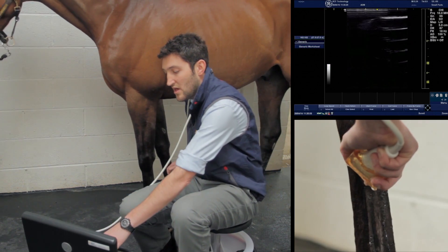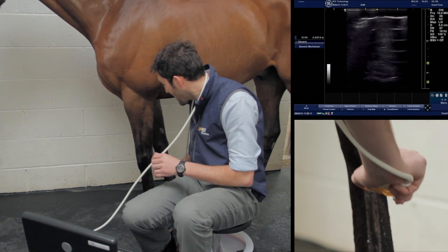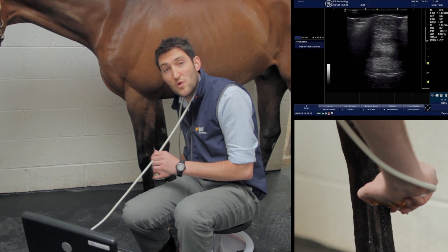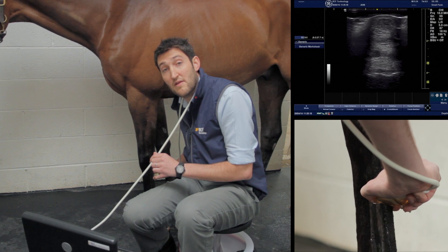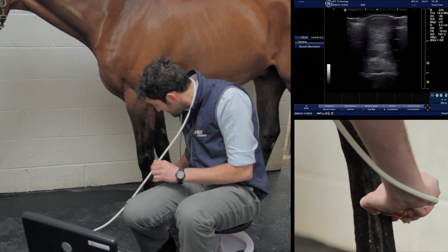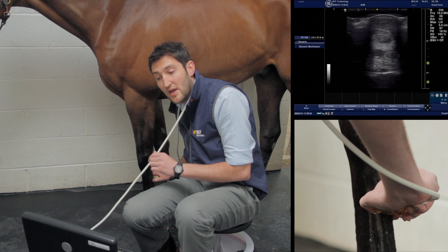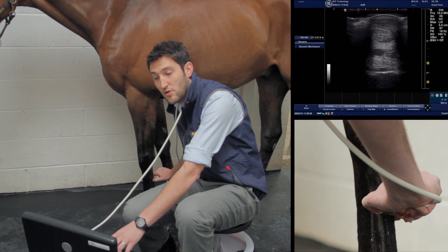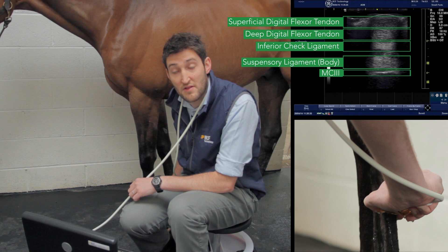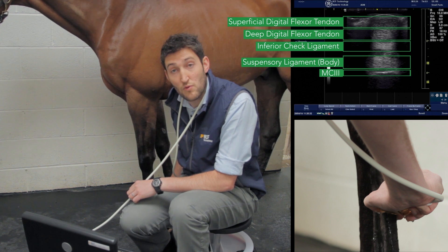Moving down to zone 2b, which is mid-cannon — approximately 10 to 14 centimeters from the accessory carpal bone. Once we've optimized the image and frozen it, you can see it looks almost identical to zone 2a, with the exception that all these structures are just starting to become wider and thinner.